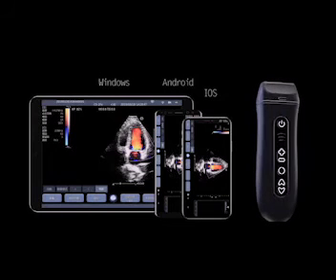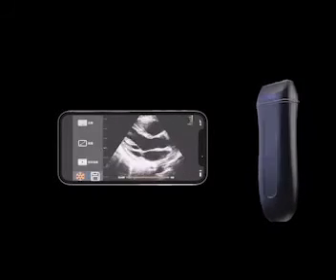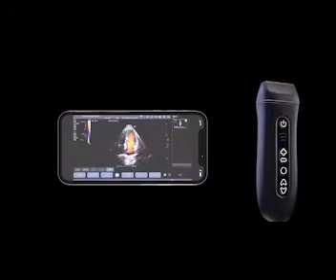Multiple platforms satisfy every need of medical professionals, providing a convenient environment for professional diagnosis. The Q7 is a revolutionary pocket-sized ultrasound system.